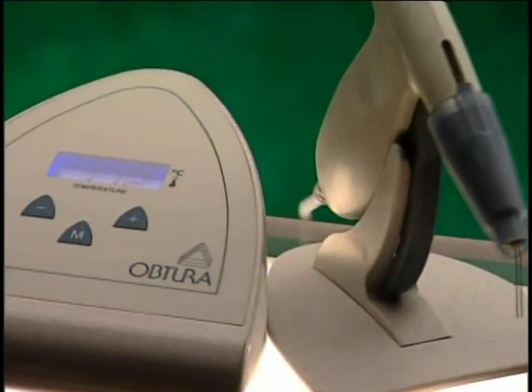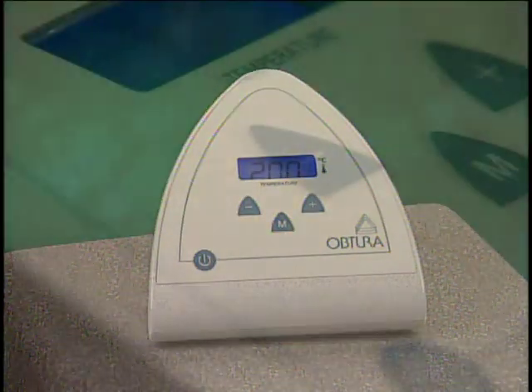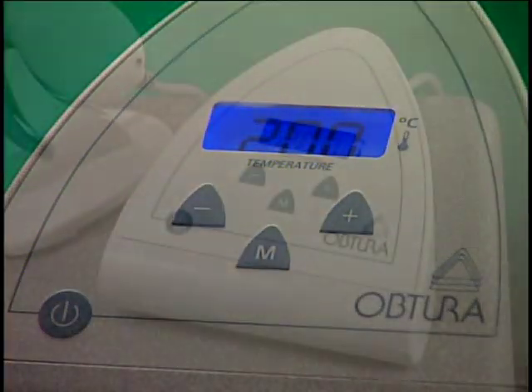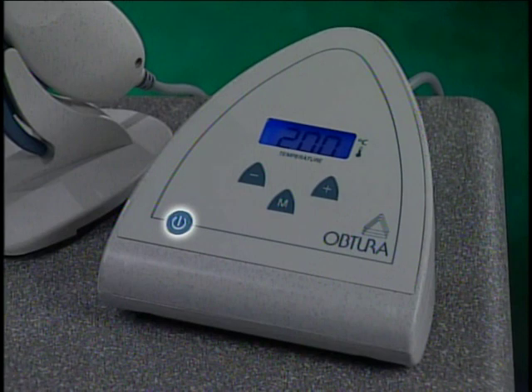Let's start with the control panel, featuring push-button switches and an LCD display. The panel's four switches are: power on, power off, temperature up, temperature down, and memory.